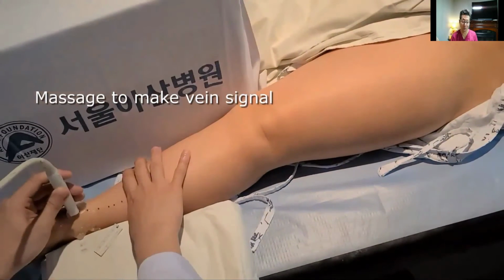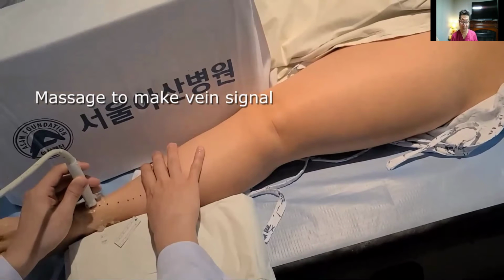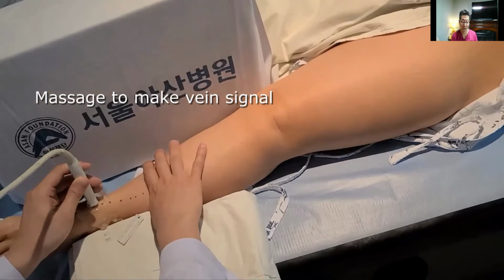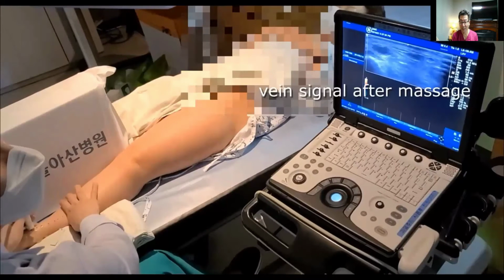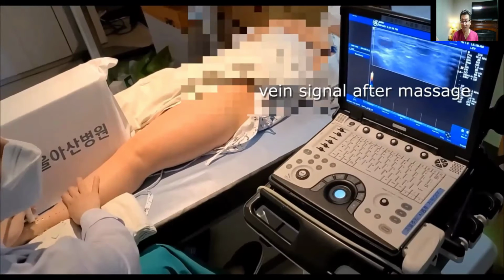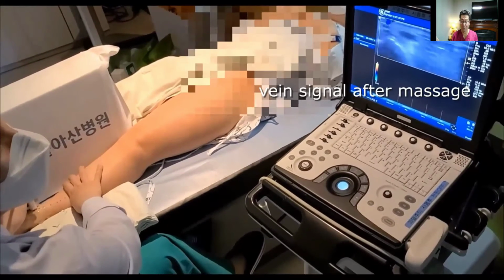Now, in order to identify the vein a little bit easier, you could use a small massage on the proximal part of the leg, which allows a better signal to be identified in the vein. Sometimes massaging increases the vein signal, which makes it easier to identify. Once we've identified the vein, you can see that every time it massages, we see the vein being filled with that signal. And then we definitely know that is a venous structure.